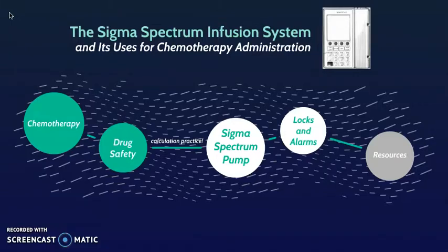Our next objective is to get a first look at the Sigma Spectrum infusion pump — how to use it and how to troubleshoot it. It might be easier for some of you to follow these steps in person with the pump in hand, but think of this portion as an introduction to familiarize yourself with the settings.